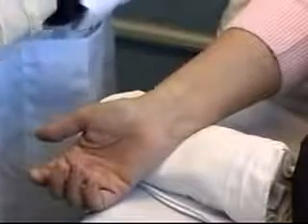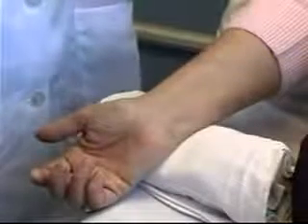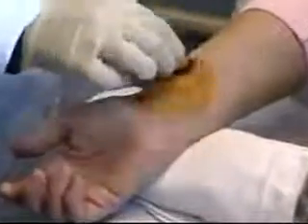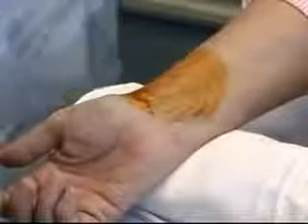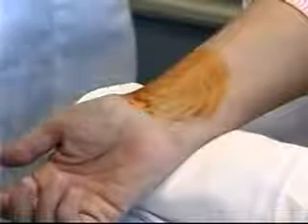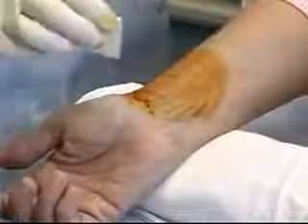The first thing I need to do is clean the area. First cleaning is going to be with the Povidone-iodine, starting in the middle and cleaning in a circular motion. After I've allowed that time to dry, my next step is to wipe away the Povidone-iodine with an alcohol swab.